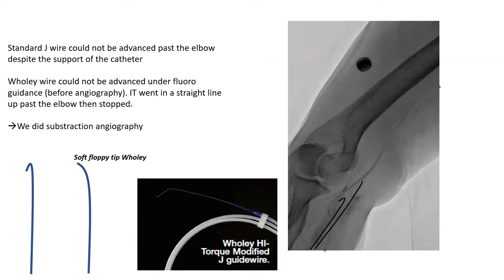This is a patient on whom I could not advance a J-wire past the elbow. I tried a woolly wire. The woolly wire went a little bit higher up, but it got stuck there. So at this point I did subtraction angiography, and this is what we found.